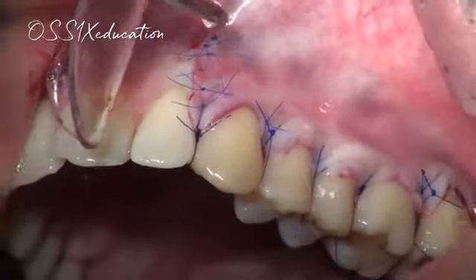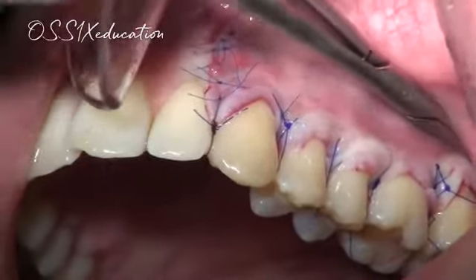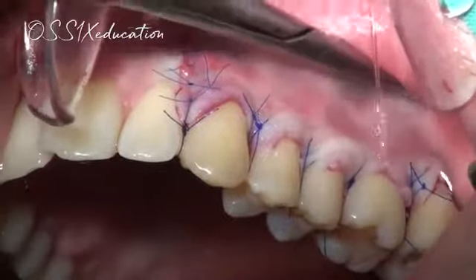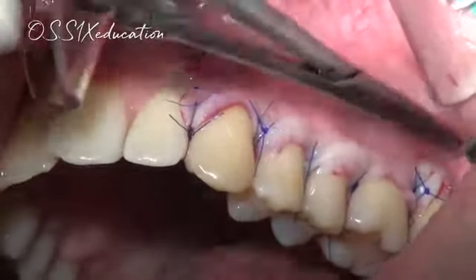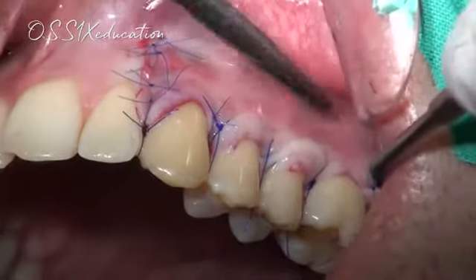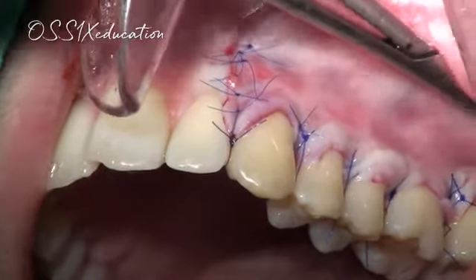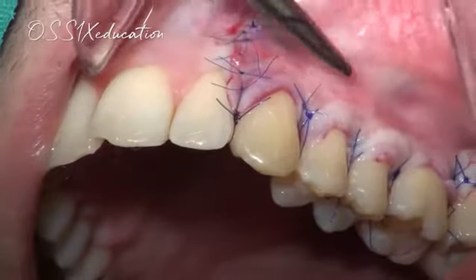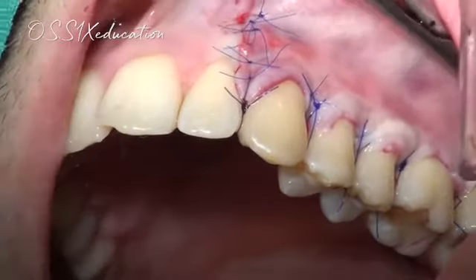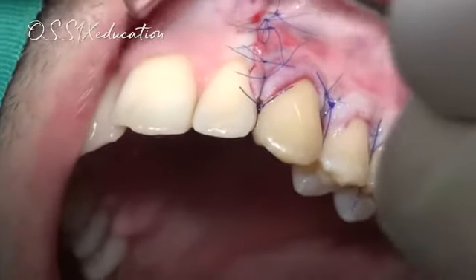And this is it. So the flap is fully closed. We can pull on the flap as much as we want. The tissue is not moving. So we have a really passive flap here. Really a lot of relaxation in the flap. So there's no movement you can see. So basically, this is how I do it on a weekly basis. I wouldn't say on a daily basis, but on a weekly basis, especially over the last year and a half. Once I got used to the material, and once I learned its limitations, so that's it.